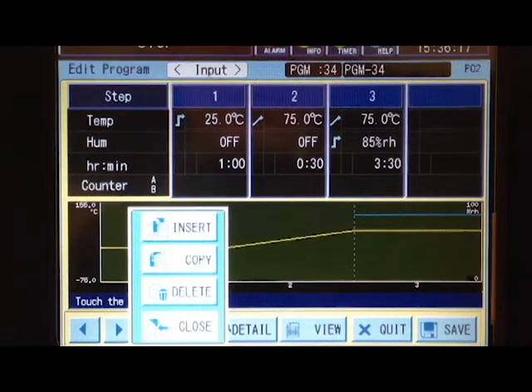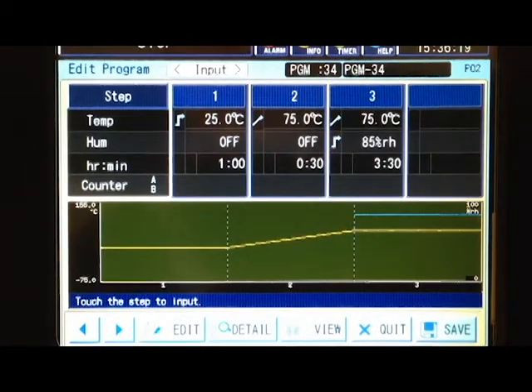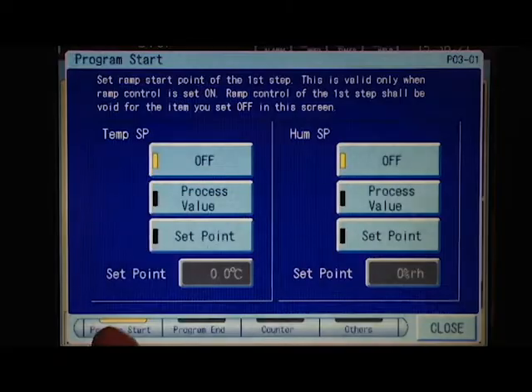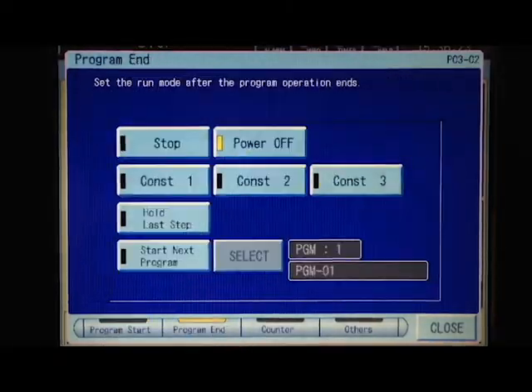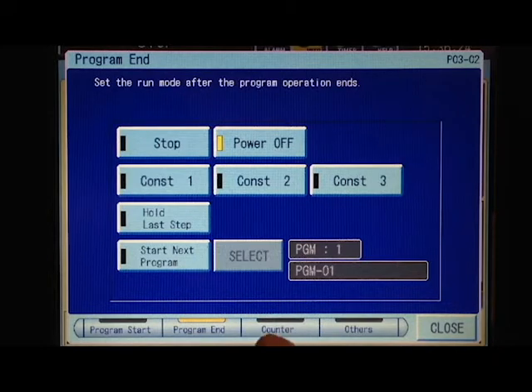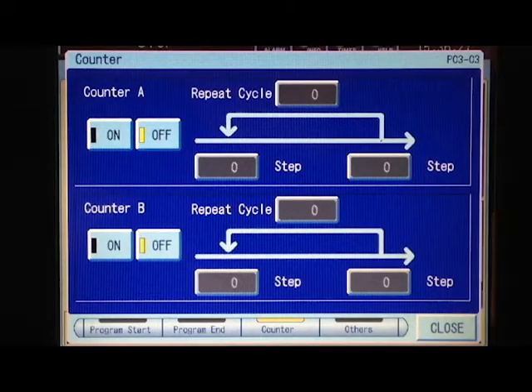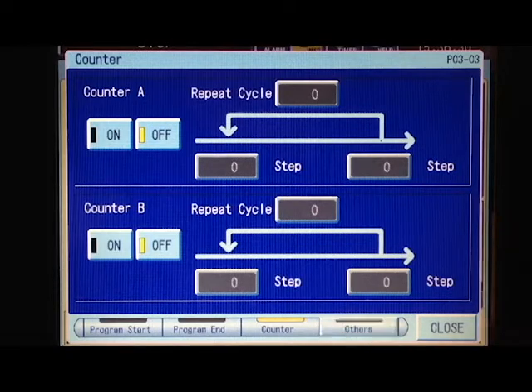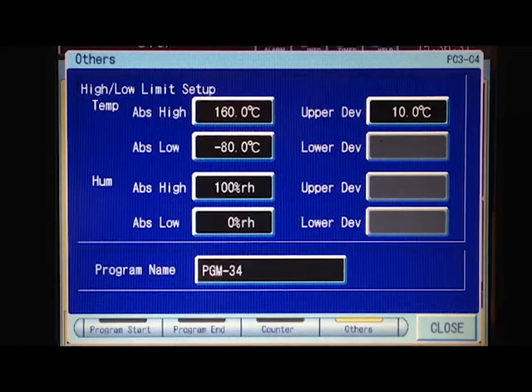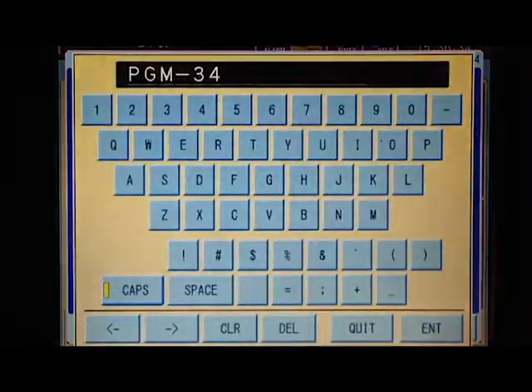We can change some details for the program overall: program start, program end, cycling counters between steps, and we can set the high and low limits for the test as well as name the program.